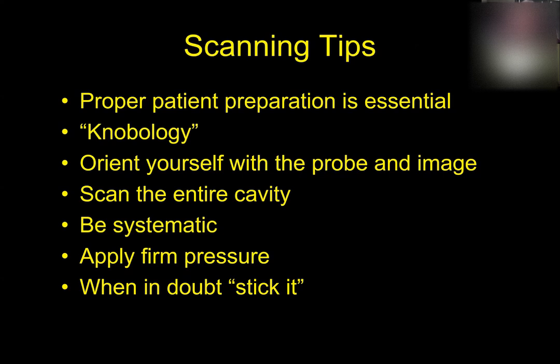Okay. So make sure that, in the real world scenario here, you're going to get a breeder person that comes in or a dog show person that comes in, and they're going to say, I think my dog needs to have an ultrasound. I think I palpate a mass. They're going to go, okay, well, we can do the ultrasound as long as you don't clip the hair. And then your answer to that should be, well, if we're going to do the ultrasound, we're going to clip the hair. Because otherwise you're going to do a half-done job, which is not what you should do.